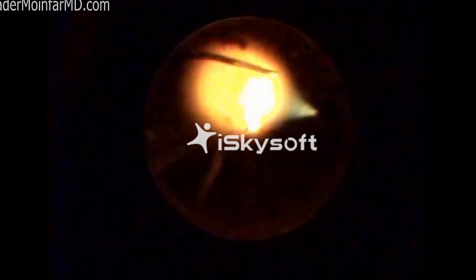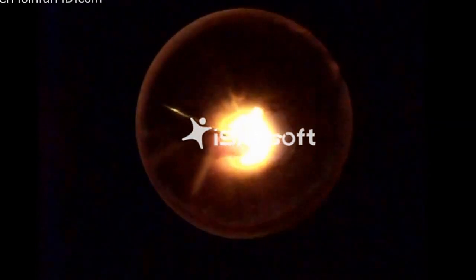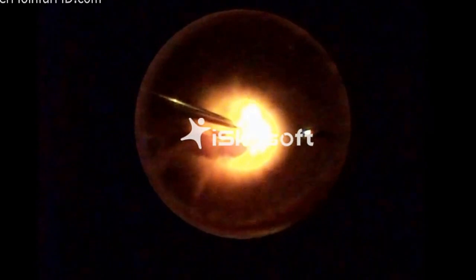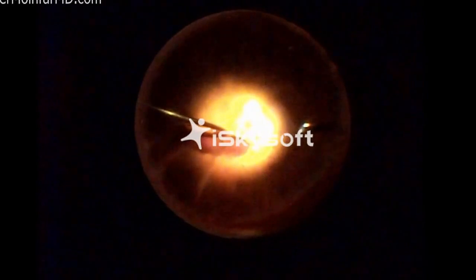So basically what I'm doing here is performing a core vitrectomy, which is removing the central vitreous. As you may recall from previous videos, the vitreous is generally the clear jelly that occupies the inside of the eye. We're born with it, and basically it just changes over age, and in most cases it really can be left alone. But in some cases, whether it be a retinal detachment or complications from diabetes, the vitrectomy is a procedure used to remove that vitreous gel.